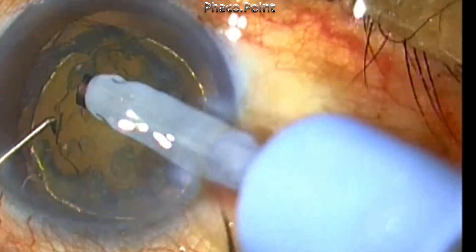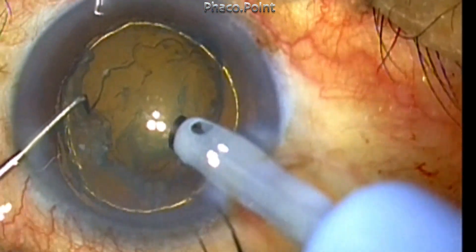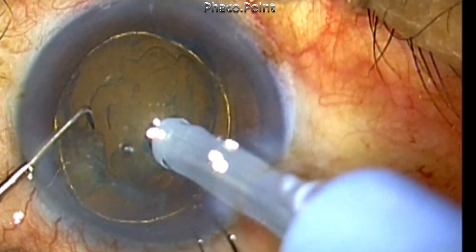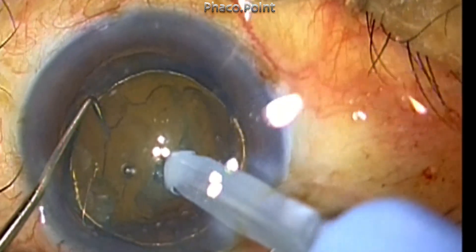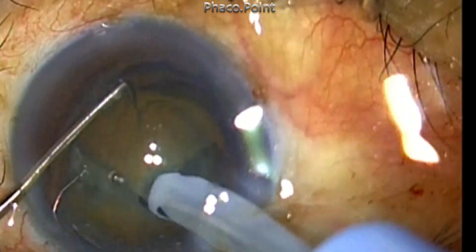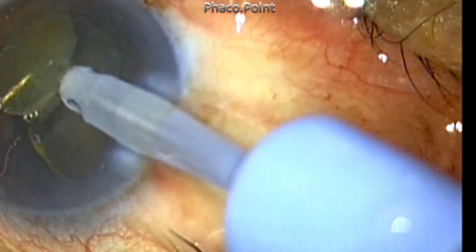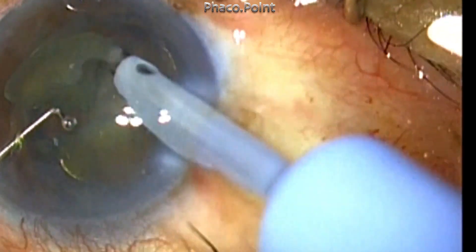This will reduce the risk of having a posterior capsular rent, especially because you don't have to carry the phaco probe to the periphery. Knowing the extent and clearly defined edges of the endonucleus will enable you to perform either a stop-and-chop or a direct chop maneuver, staying well within the confines of the external extent of the endonucleus substance.